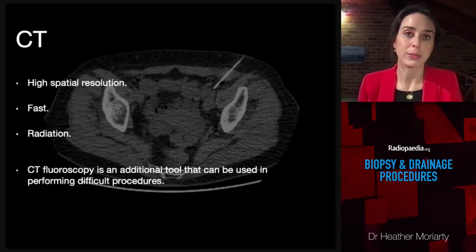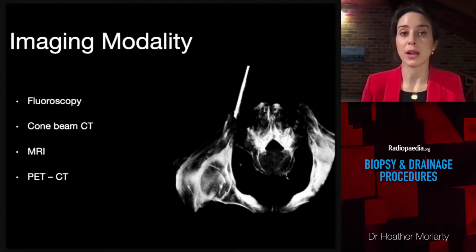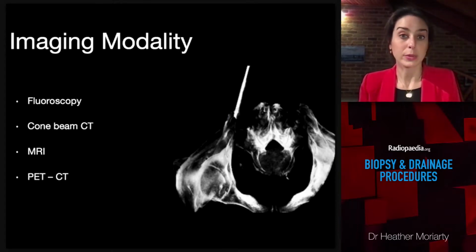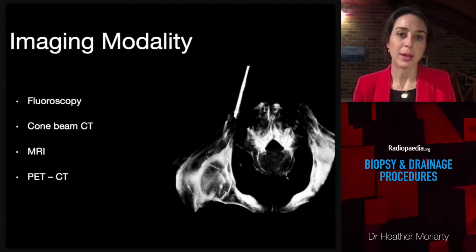particularly time-sensitive component. The combination of fluoroscopy and ultrasound I like a lot, perhaps particularly for performing drainages with the Seldinger technique. It helps avoid loss of access or guidewire kinking during a tract dilatation. Cone beam CT can be useful, particularly if it's difficult to get CT time. MR and PET CT have a few unique benefits. Generally, time is more costly in MR, but it is useful for soft tissue lesions because of the intrinsic high contrast resolution.